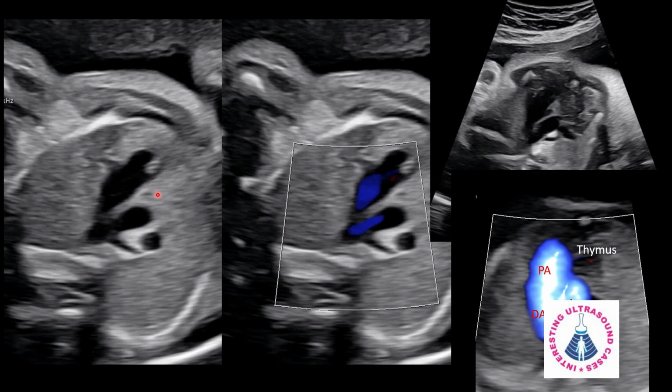In the three vessel trachea view, we can see the ductal arch, the pulmonary artery forming the ductal arch, and the aorta forming the aortic arch, and the two unite to form a V configuration. This is the three vessel trachea view, and we can see the trachea. In front of the vessels we can see the thymus. Here we can see the SVC and trachea.